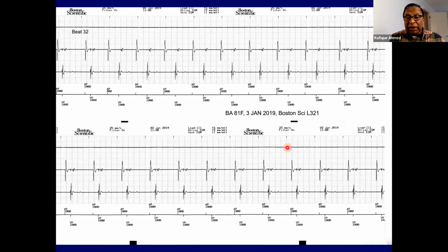And then after a little bit, again, it will search. Now, this feature, as I told you, should be programmed in places where you want to minimize ventricular pacing and you believe there is AV conduction. Otherwise, you don't want to program this feature. This feature, any feature in a pacemaker, wastes battery. Even if you save 1 month of battery, it's important. So features that are not necessary should be turned off in pacemaker programming to make the pacemaker simpler.